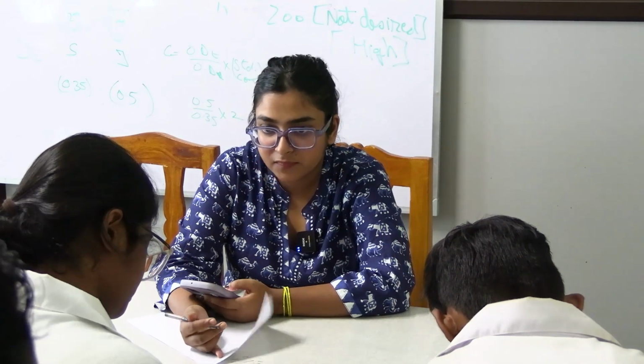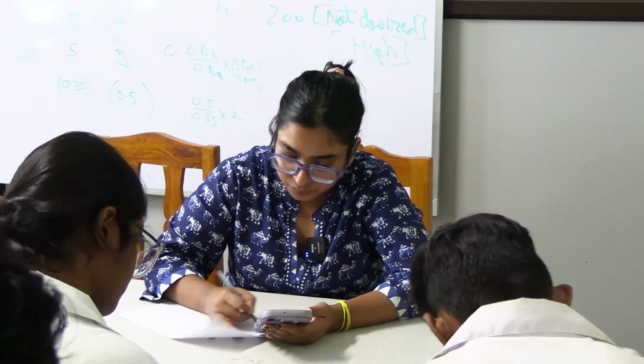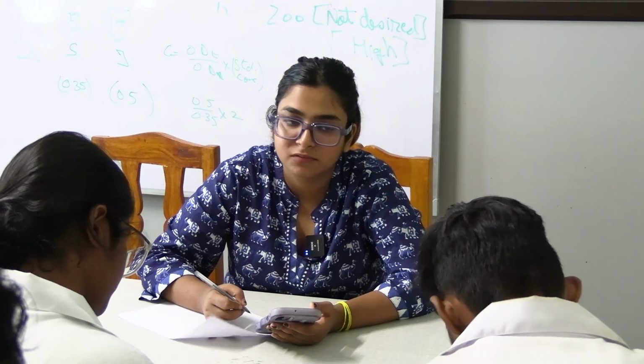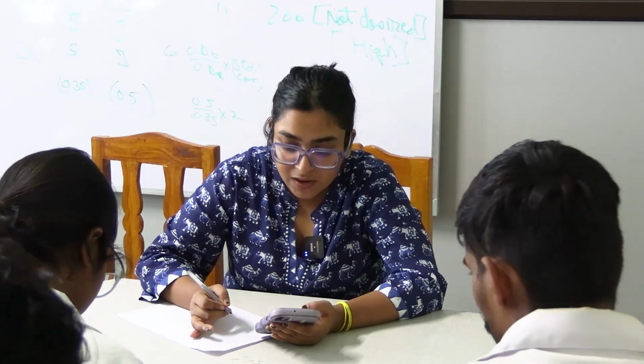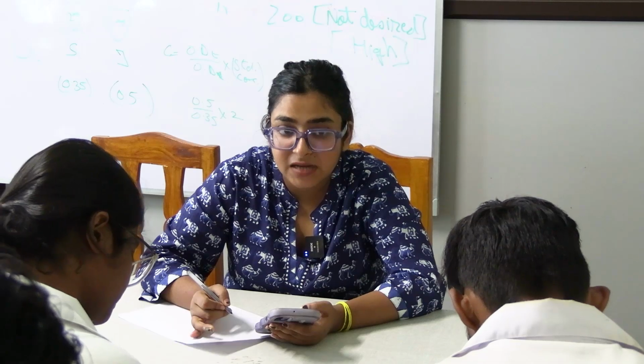Okay, oxygen, supplementary O2. A sample for ABG analysis is drawn. Clear? Okay. Now write down the ABG findings.